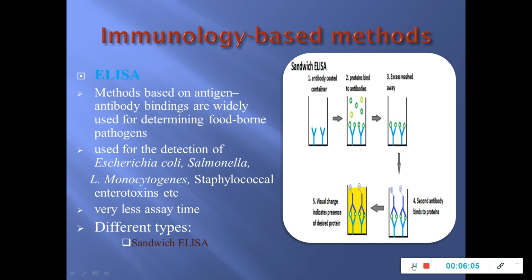Firstly, what you should have is a basic idea. First of all, you remember that against every antigen, your body produces an antibody, and that antibody is used here for the ELISA based technique. You might think, how does an antibody form and how will you analyze that in a food? Basically, what you can do is check whether the antigen is present in the food. So, synthetically or using various other techniques like monoclonal antibodies, that is, by using different mouse based techniques, the antibodies against each antigen are produced in a lab separately, and you will get antibody coated wells.